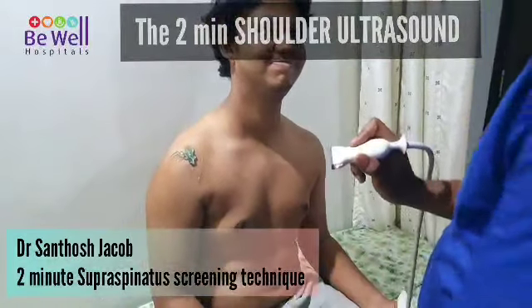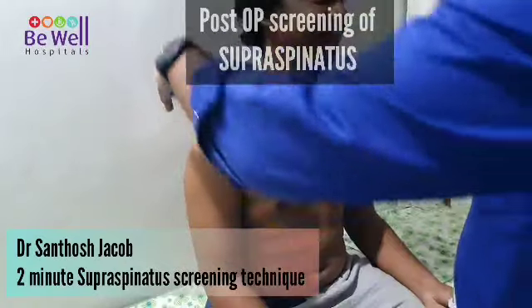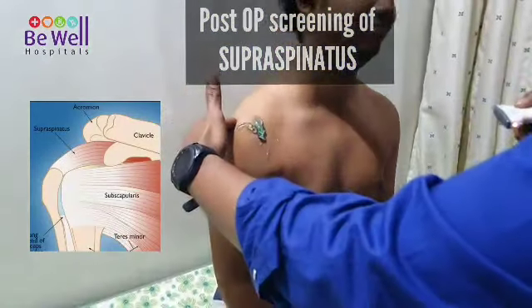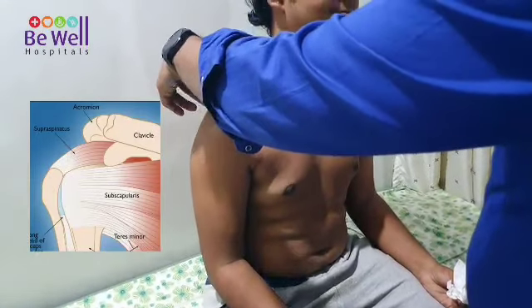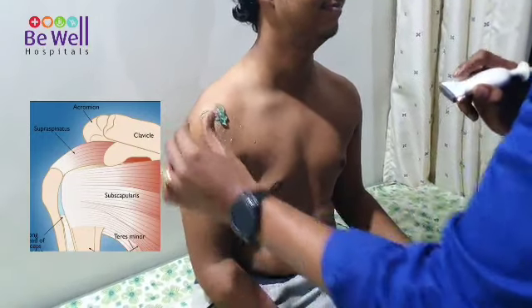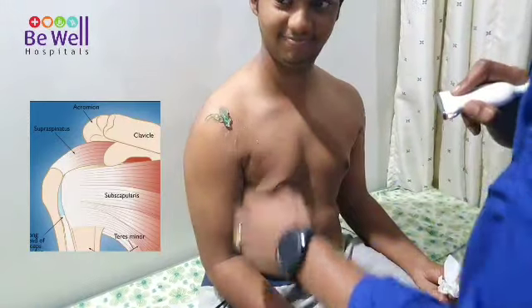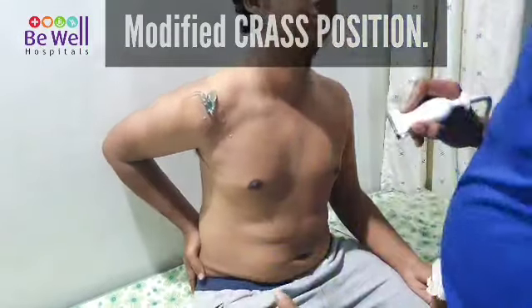Now I am seeing his rotator cuff. If you see anatomically, the rotator cuff starts from above the spine of the scapula. It arises on the supraspinous fossa, comes under the surface of the acromion and inserts onto the humerus. Now, in order to bring the supraspinatus to our vision, we use a position known as the modified Crass position.